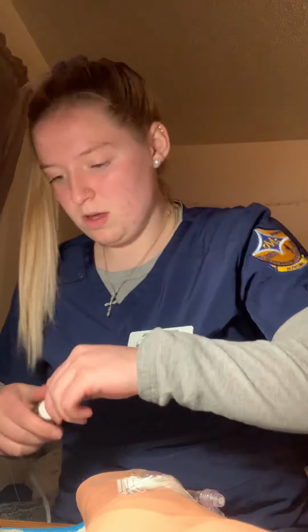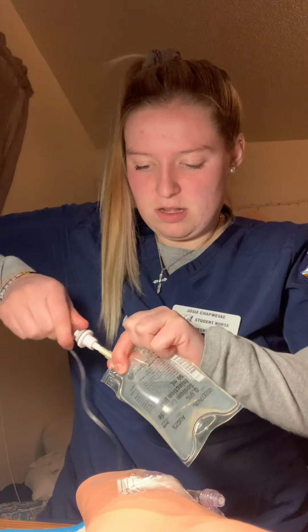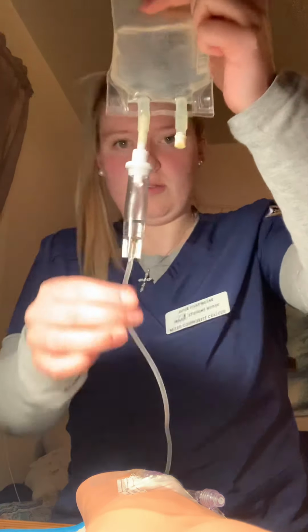All right, and then we will get our secondary tubing ready here. We'll be sure to close the roller clamp. Then we'll take that off, this off. Then we'll fill the drip chamber here, about halfway to that line there.